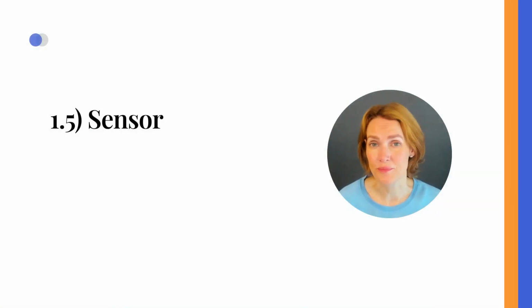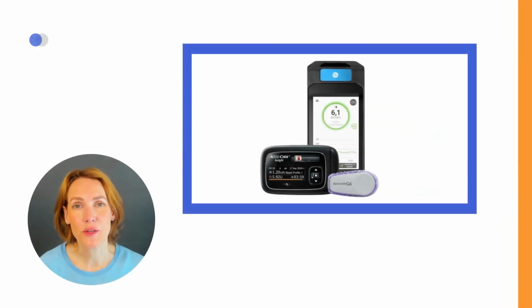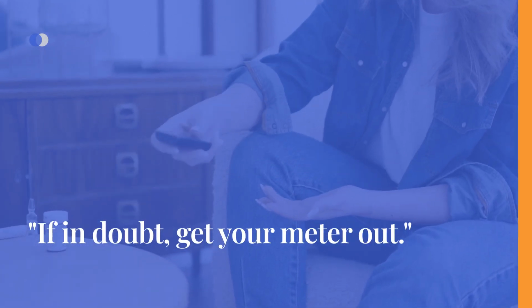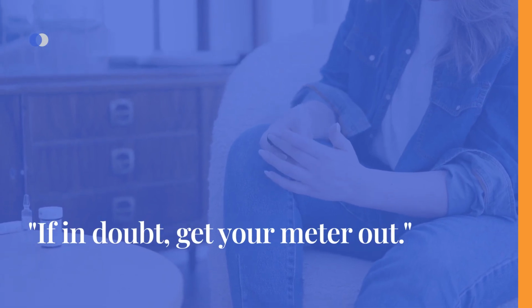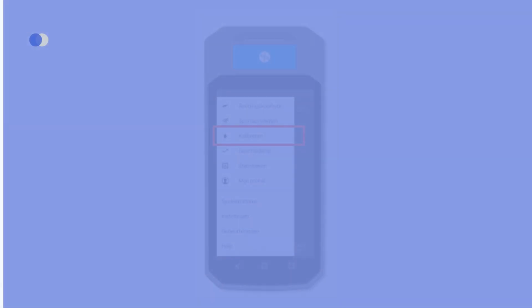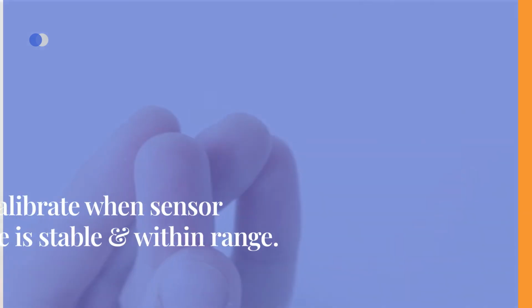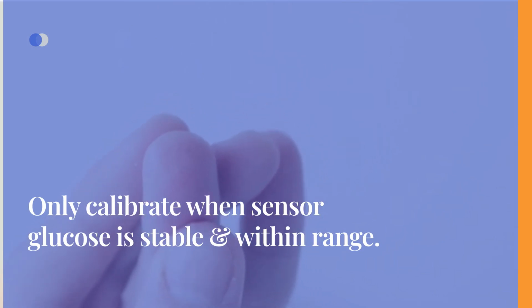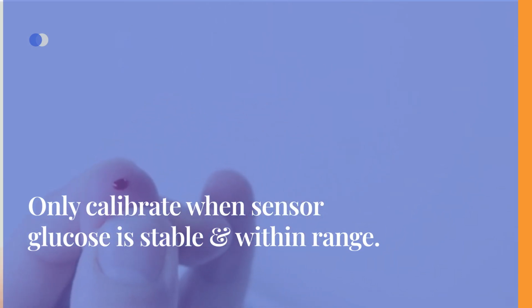1.5. Sensor. Diabeloop utilizes the Dexcom G6 sensor for glucose monitoring. In case you have doubts about the sensor's readings, it is recommended to perform a finger prick test for verification. If there is a significant discrepancy between the sensor glucose reading and the finger prick measurement, you may consider calibrating the Dexcom G6 sensor. However, it is important to calibrate only when your glucose levels have been stable and within the target range for the past few minutes.